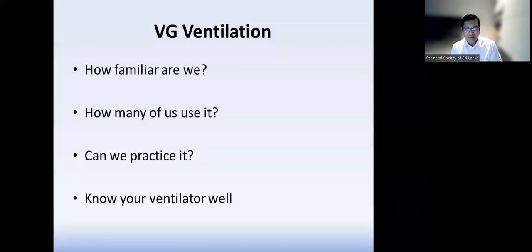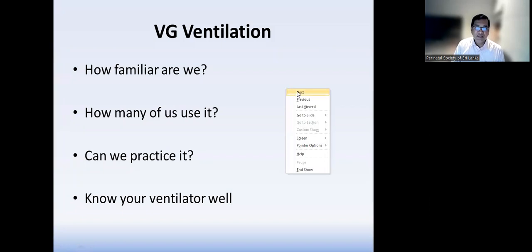එතකොට A machine වල flow sensor එකක් endotracheal tube එක ගාවට තියෙන්නේ නැහැ. කිසිම විදියක flow එකක් කිසිම measurement එකක් endotracheal tube එකට ආසන්නයෙන් ගන්නේ නැහැ. ඒක ගන්නේ within the machine. So the machine is still measuring the volumes within the machine, before the patient circuit. So there can be a lot of volume loss, and the accuracy of the volume is not very good. Therefore, if you are using those machines, the volume ventilation is not very accurate, and it can be dangerous. I hope the point is clear. So know your machine first and see whether the machine takes the volume measurements at the patient end before you do volume guarantee ventilation. That's a very important message.